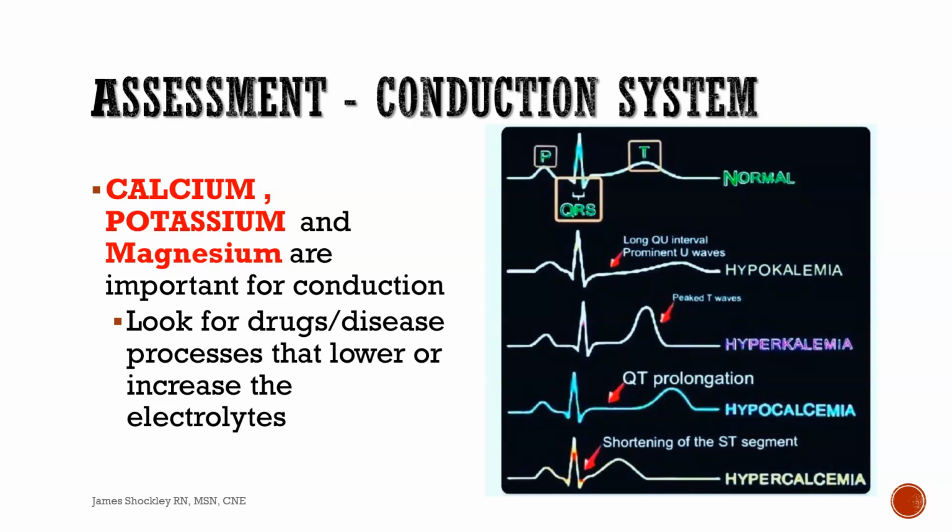Right? I'll be perfectly honest, you see the hyperkalemia one that says the peaked T waves. All my students think every patient has tall peaked T waves, and none of them have hyperkalemia, because you can set the sensitivity of the machine to make your PQRSs bigger or smaller. So my advice to you is to make sure you're reviewing your lab results before you go talking about tall peaked T waves.